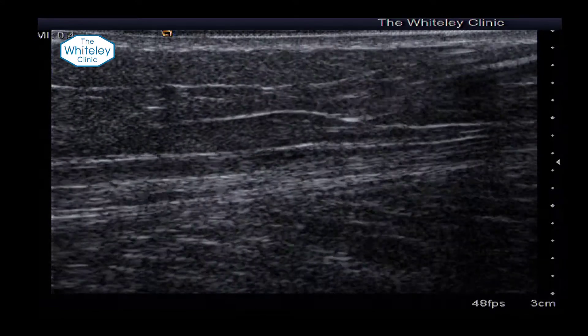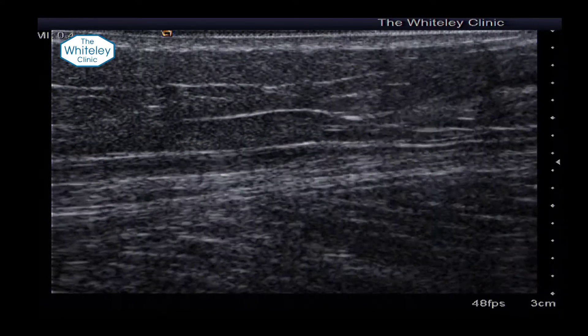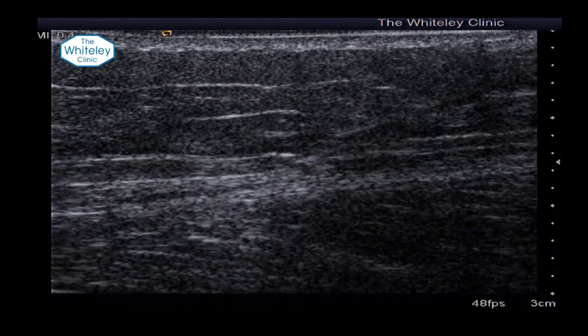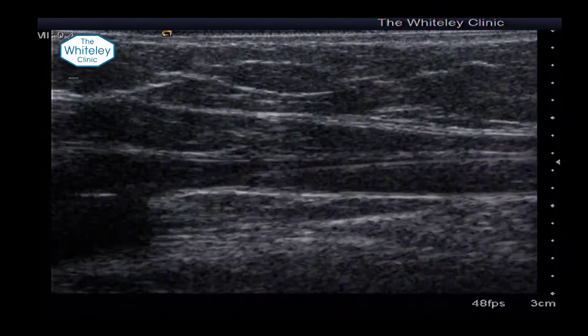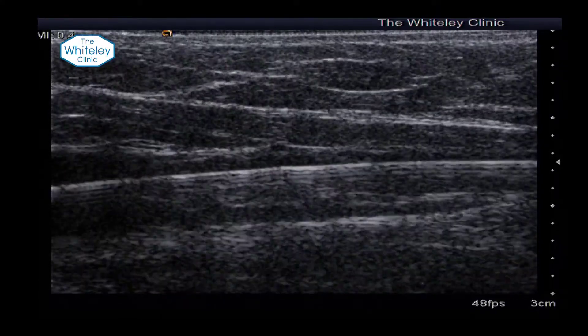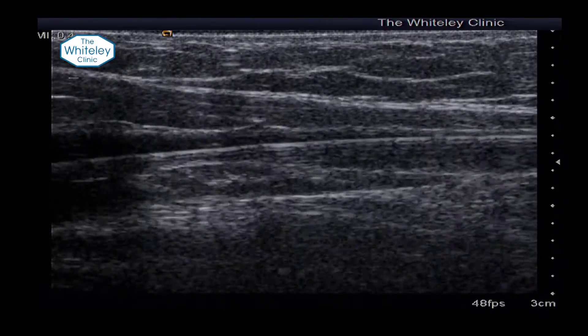We line up on the ultrasound. You can still get into a spasmed vein most of the time — it just is obviously a smaller target. We can see there on the ultrasound the wire going up. In transverse section it looks like a little star; in longitudinal section you can see the actual wire going up.